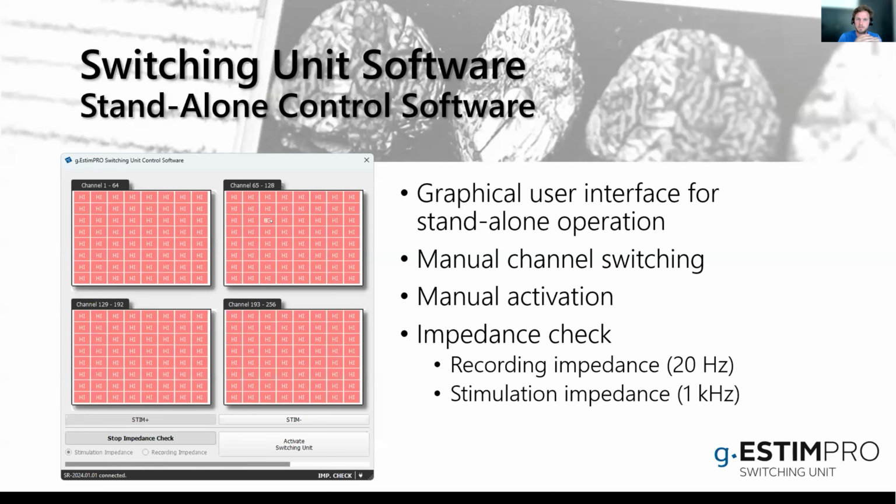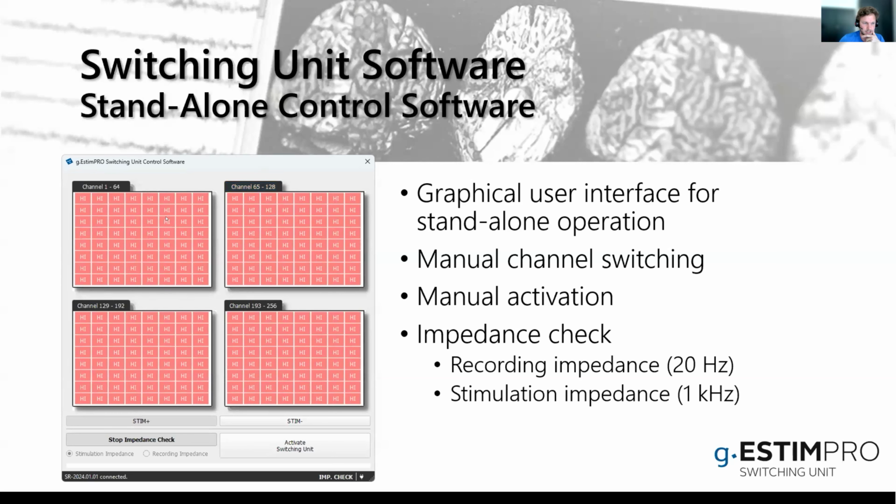So it's always important to keep the impedance as low as possible. And here you can see, since nothing is connected, I have high impedance all over the place. But now I will connect, I can show you. I have a saline solution here and then a grid. So this is kind of salt water. It's mimicking the milieu of brain tissue.